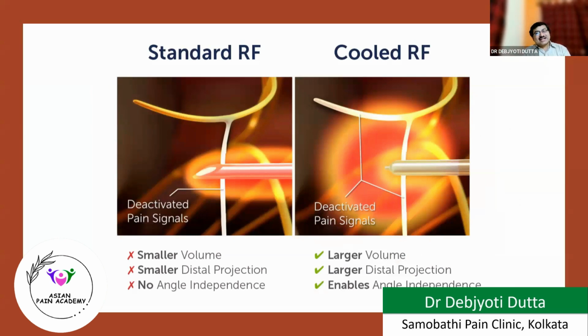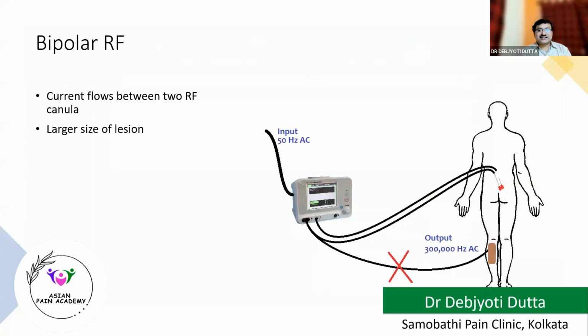Now, there is another way of increasing the lesion size that is known as the bipolar radiofrequency. But before going to the bipolar radiofrequency, do you have any questions regarding the cooled radiofrequency? You can ask me. No question. Okay, fine. Thank you.